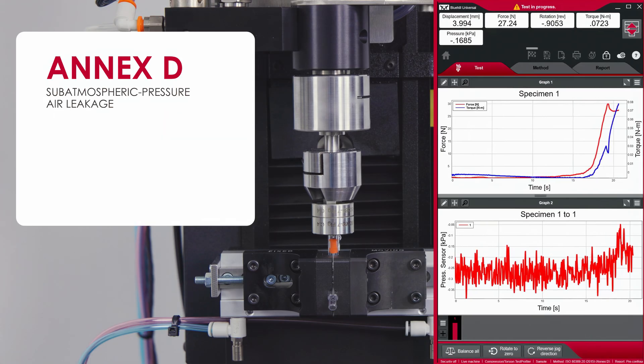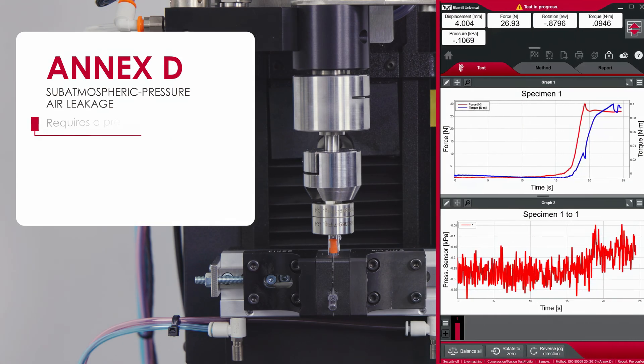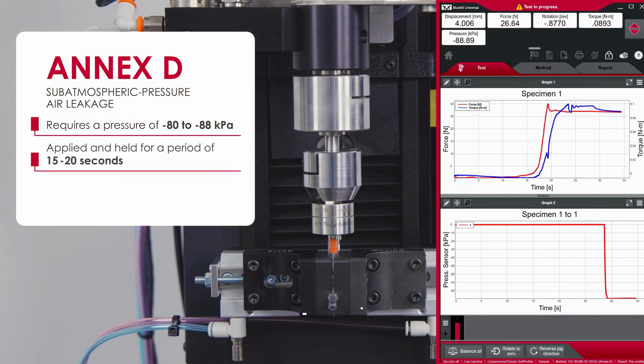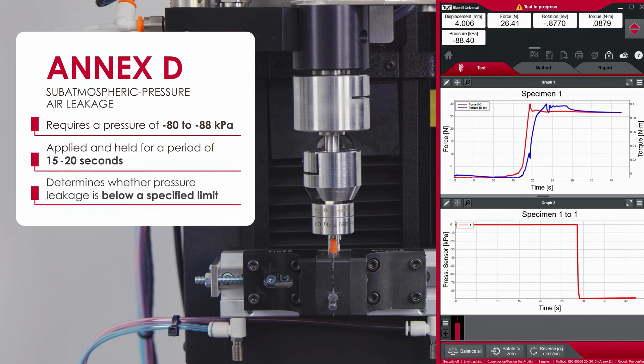Annex D, subatmospheric pressure air leakage, requires a pressure of negative 80 to 88 kilopascals be applied and held for a period of 15 to 20 seconds to determine whether pressure leakage is below a specified limit.